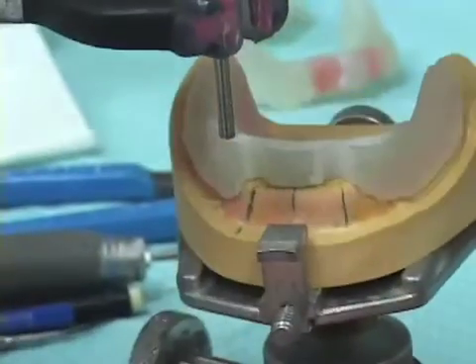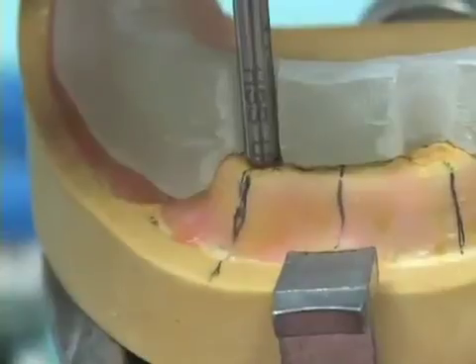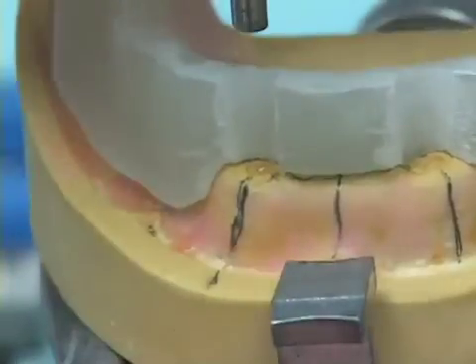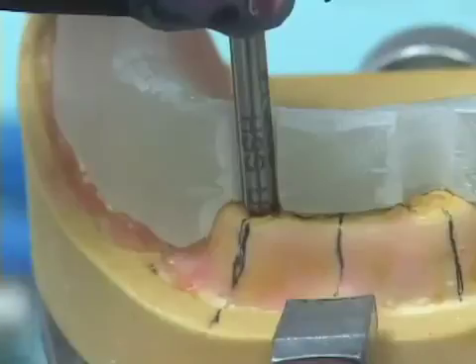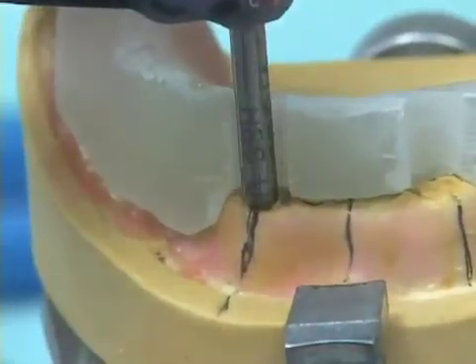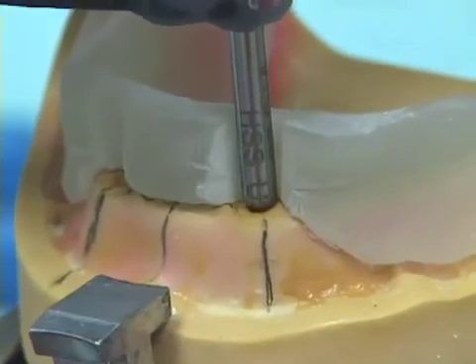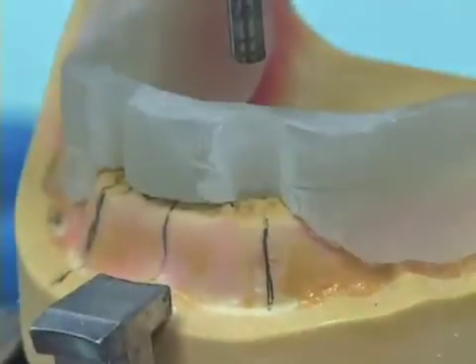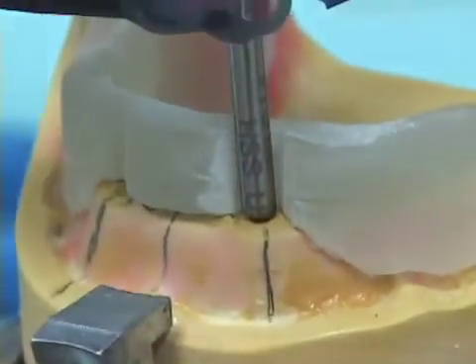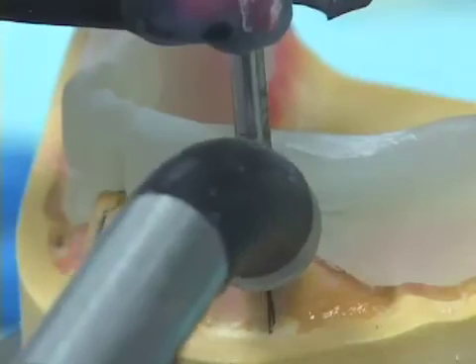What we now do is just like we did before and basically orient our drill blank exactly, I mean exactly, over the proposed implant location, lift it up, add our triad gel, carefully lower the drill blank straight down, and then take our Peter K. Thomas instrument, distribute the material around the drill blank, come in and cure it. Same thing on the other side, get the exact orientation, bring it in, lift it up in the air, triad gel in place, lower it back down, use the Peter K. Thomas instrument to distribute the material, and then very carefully come in with the light curing wand and cure it.